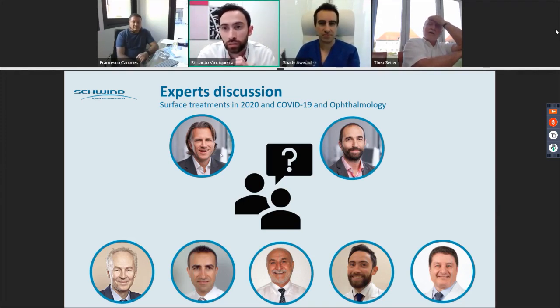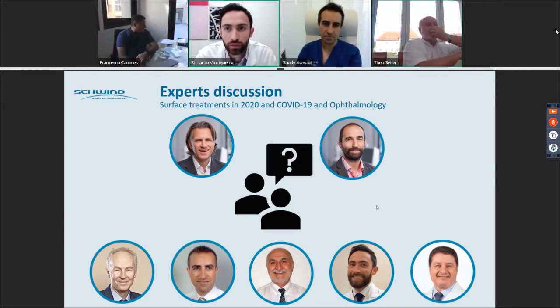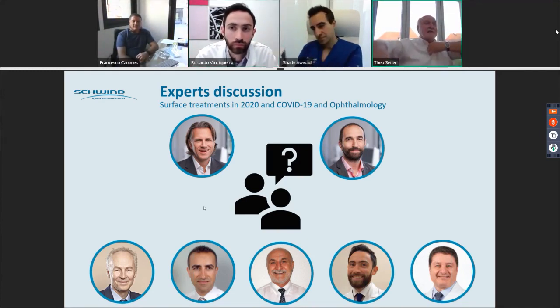Yeah, Riccardo, I understand that. But now the question is, if you put in a drop, the tear film is flowing away and changing the surface. As you know, they are blinking twice and then they get a different value, even a different refraction. So how do you standardize that situation after epithelial removal and then doing a topography? So you mean the acquisition, right? Yeah, you remove the epithelium. The patient sits at the slit lamp, gets 1 drop of hyaluronic acid before, and then how long do you wait until you make the measurement?